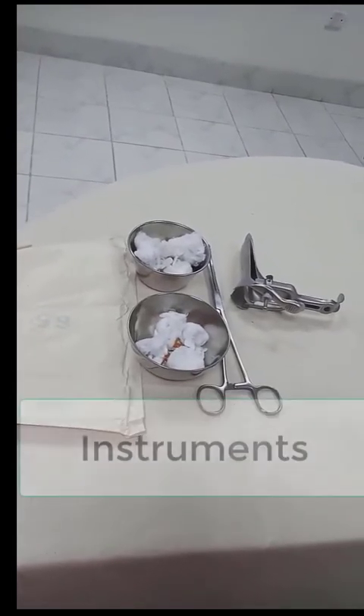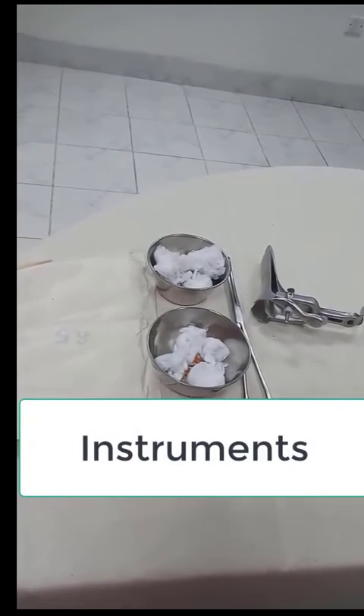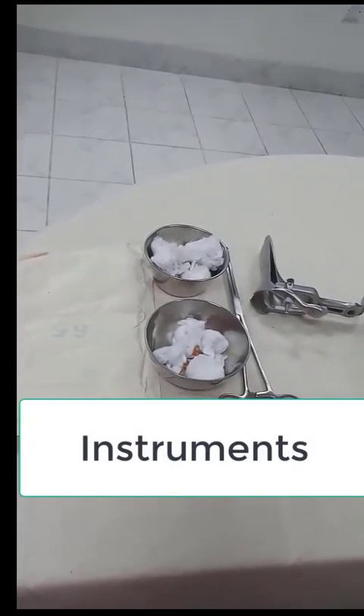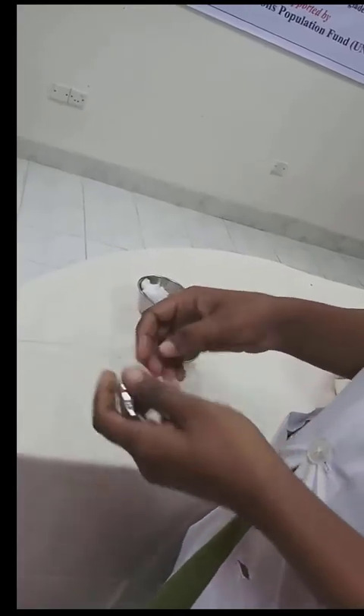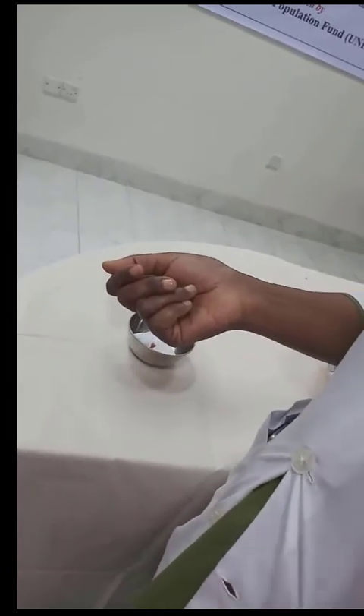These are the instruments for visual inspection of the cervix examination: a Cusco speculum, a sponge holding forceps, and a gallipot are needed. First, hand washing is done and gloving.